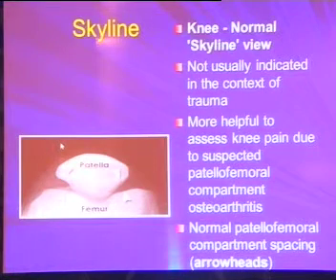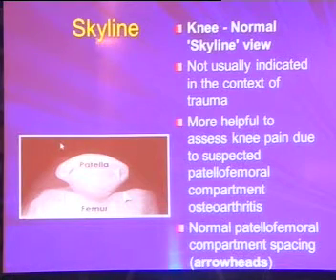You should make sure that the knee is not in 90 degrees of flexion, because in that condition the patella automatically centers over the trochlea. So you must always advise that it should be done in 30 to 45 degrees of flexion. That is mainly done for patellofemoral problems, and we'll discuss that during the patellofemoral session.